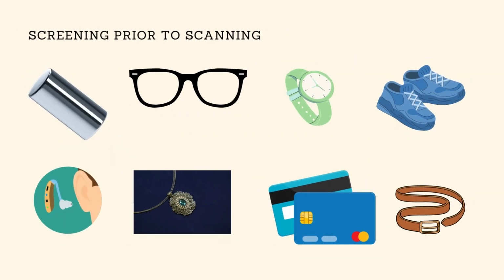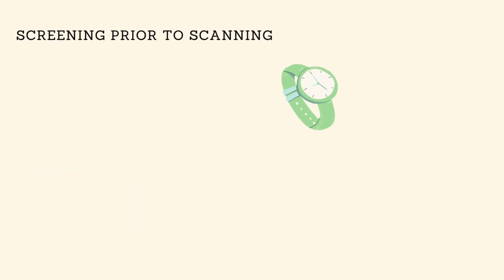Also, personal belongings such as those being mentioned should be excluded: glasses, removable dental work, hearing aid, jewelry, watch, wallet or money clip, pens or pencils, keys, coins, pocket knife, metal zippers or buttons, belt buckle, shoes, magnetic strip cards, credit cards, bank cards, etc.